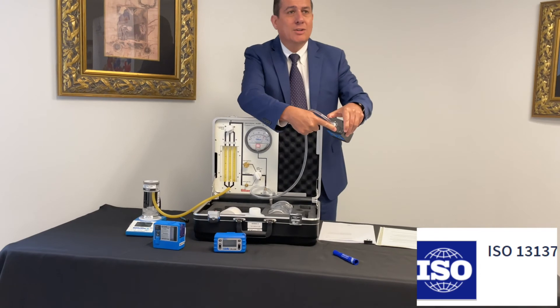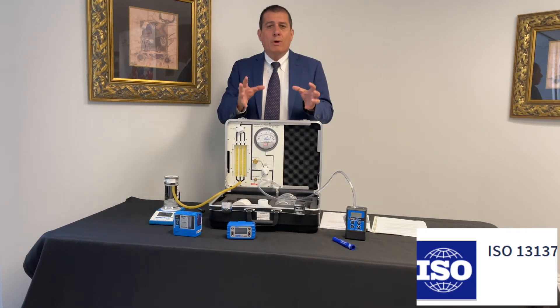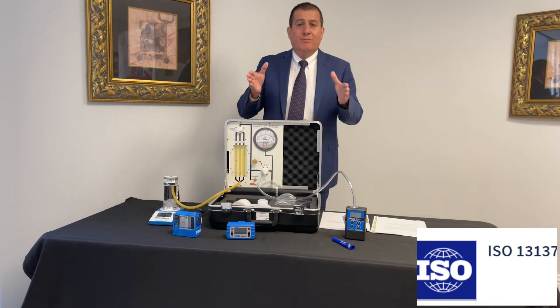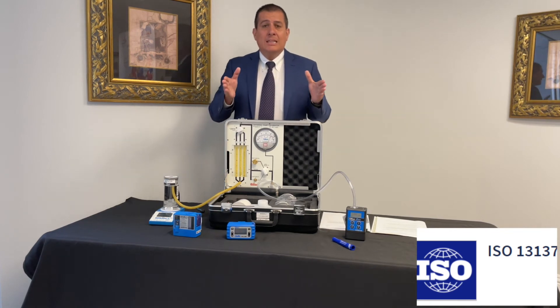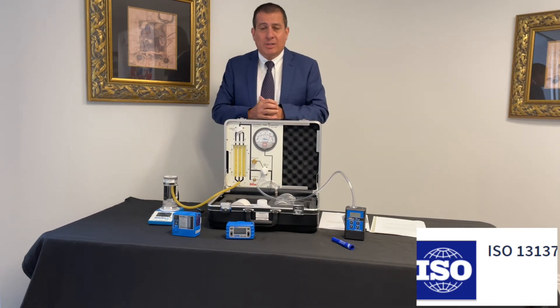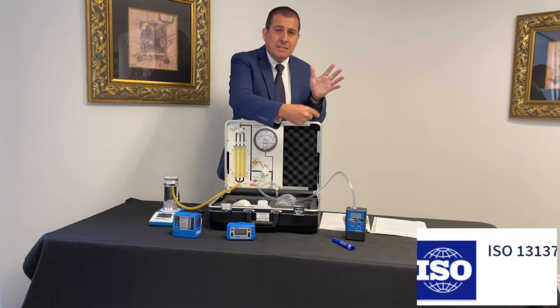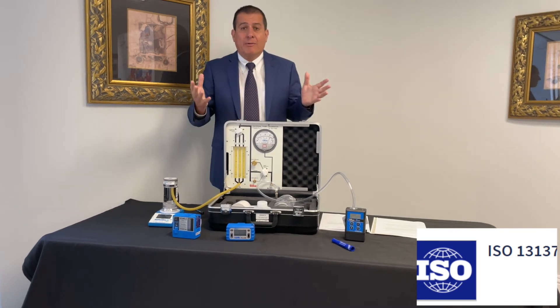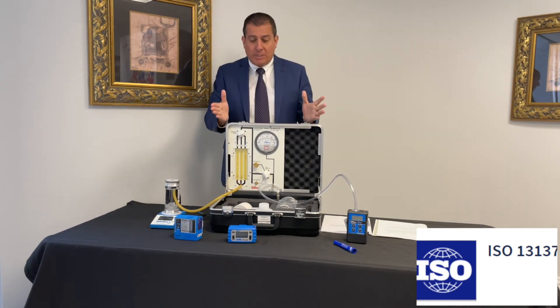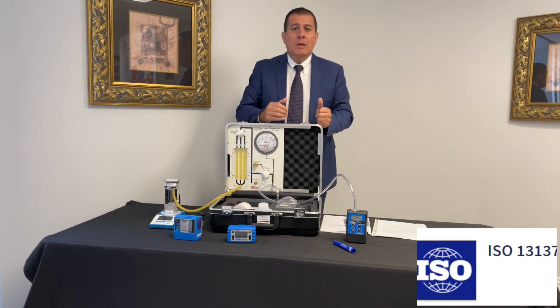At 40 inches of back pressure, the light is still green, which means the pump can operate at three liters a minute at 40 inches of back pressure. This is important when going out in the field to make sure that pumps are constant flow and maintain flow within plus or minus five percent. Not all pumps manufactured out there are able to withstand such high back pressure capability. The higher the back pressure, the more current the battery draws, which means you have to recharge the battery more frequently. With this pump, you're able to work at any flow rate depending on the application, even in very harsh environments.